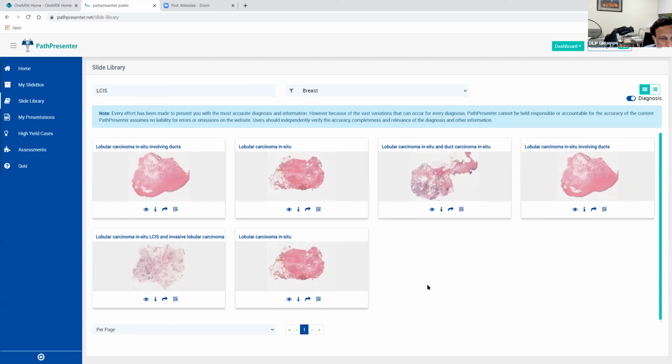But anyway, a lot of the literature on pleomorphic LCIS has come about after the advent of the E-cadherin era. That is another reason why the data are limited. But I'm sure in the years to come, we will have good enough data that will lead to some kind of definitive guideline. Even today, we report pleomorphic LCIS or florid LCIS if it is close to the margin or at the margin in surgical specimens, because they will probably go back, although not all surgeons will do that.